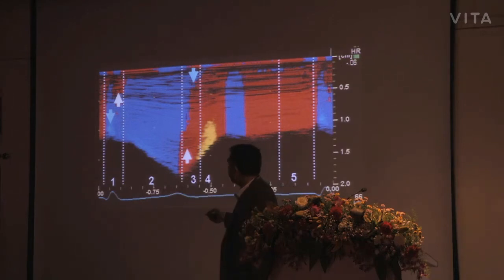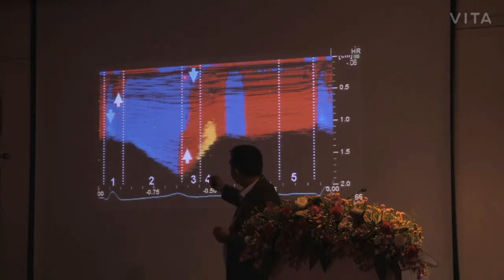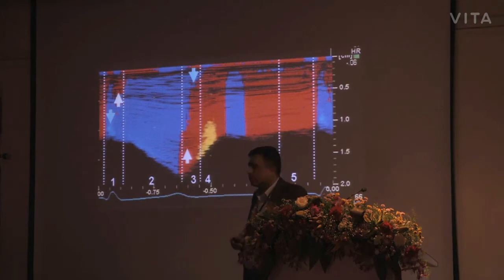So this is one peculiarity which repeats again in the isovolumic relaxation period. You can see here in red that the endocardium is actually relaxing, and it is going towards our probe, which is placed here. So red is anything that's towards the probe or relaxing. At the same time, the corresponding epicardium is actually contracting. So this is again, as I told you, a result of the double helix. Just keep this in mind because we're going to come back to this when we see our strain and strain rate curves.